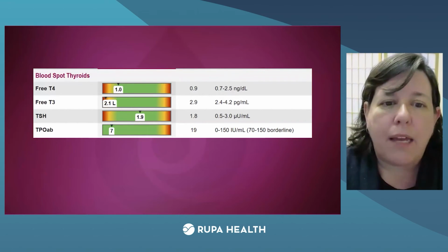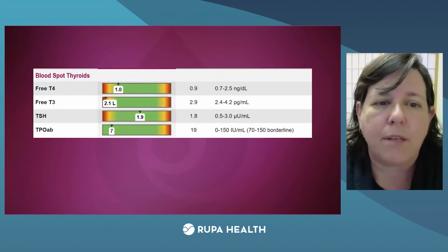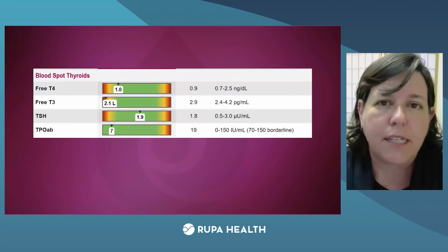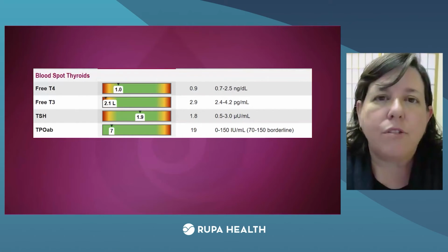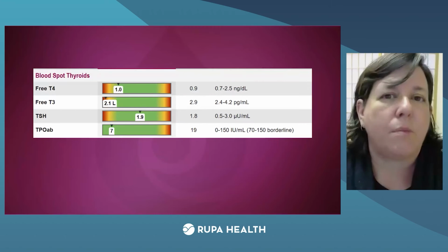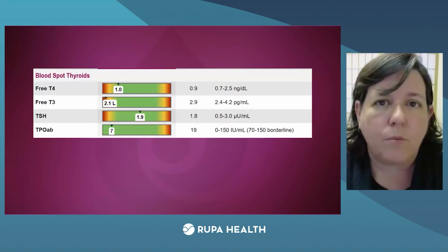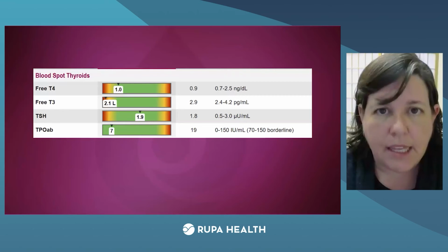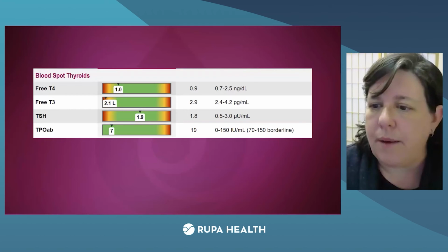T3s are helpful, but once again, newer tests, and you could track these over time and you can see what this person's doing. T3s being low, just be really cautious. And if you're using T3 for supplementation, which we'll talk just briefly about supplements and nutrients right now and thyroid medications, just know it's very suppressive on your TSH. So you're going to see that in labs when you use T3. You just have to really know what that person's doing, how routine they've been about taking it, and make sure you're trying to compare apples to apples when you do it.